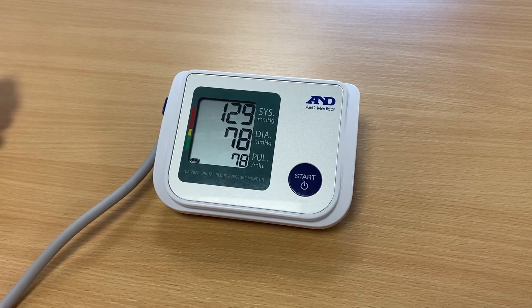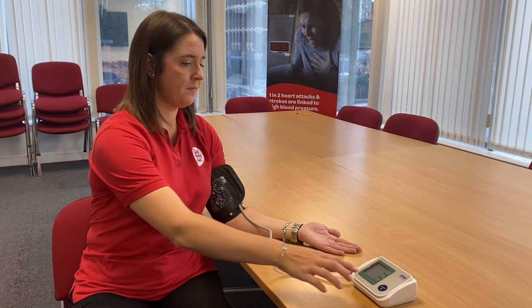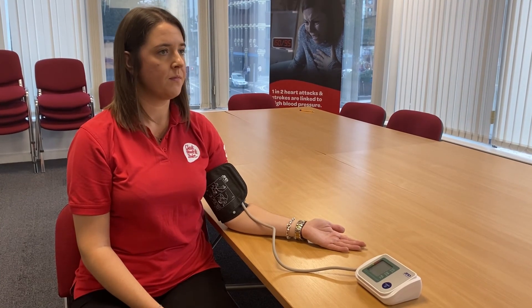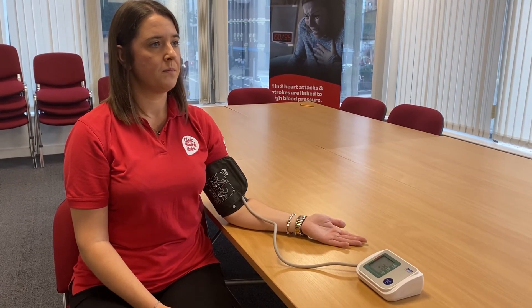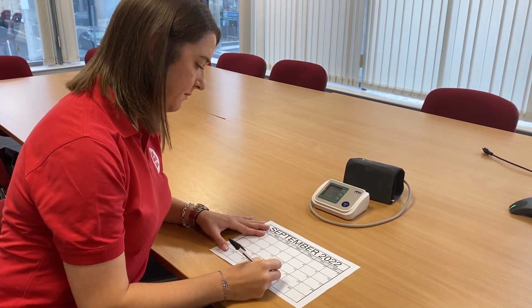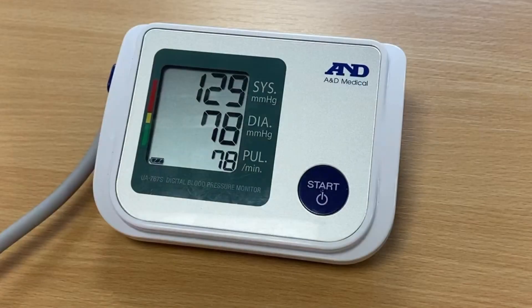Take two or three readings, each about one to two minutes apart. If your first reading is much higher than the next, ignore it and take an extra reading. Once you have two to three readings you can work out the average. Keep a record of your measurements and write them down exactly as they appear on screen.